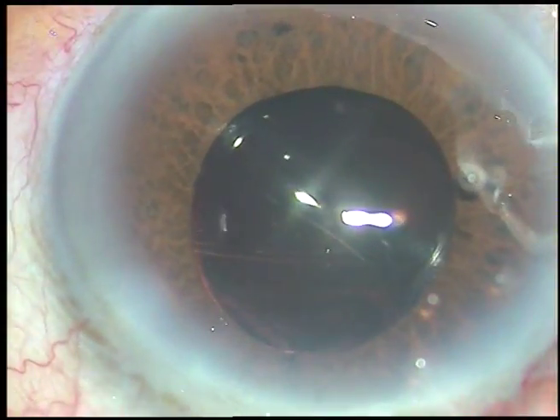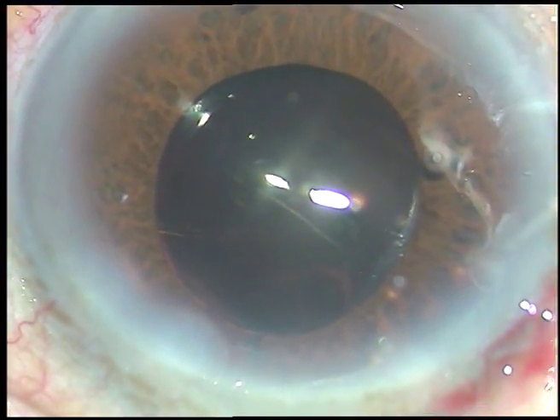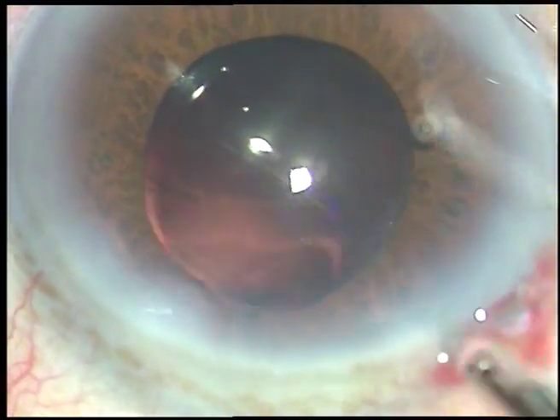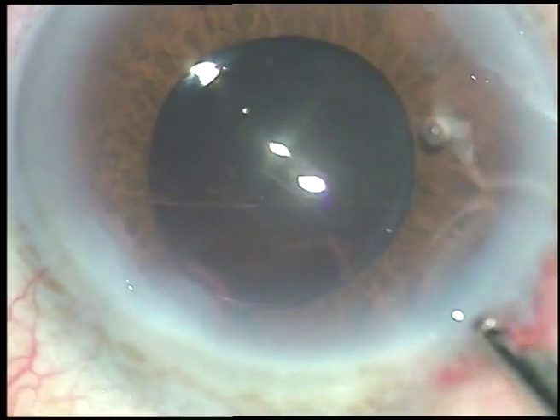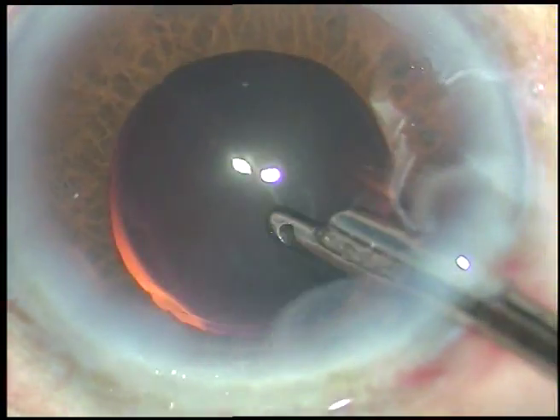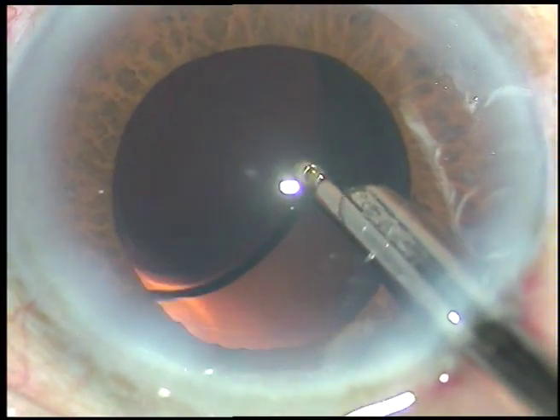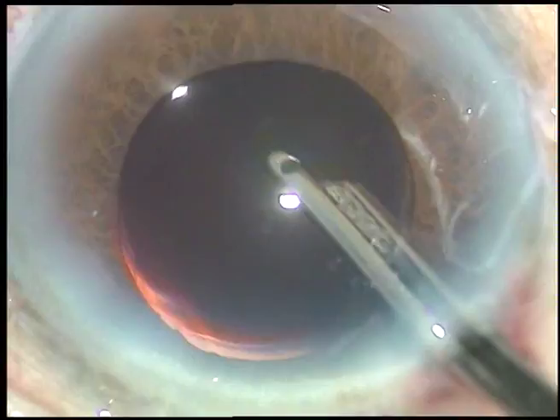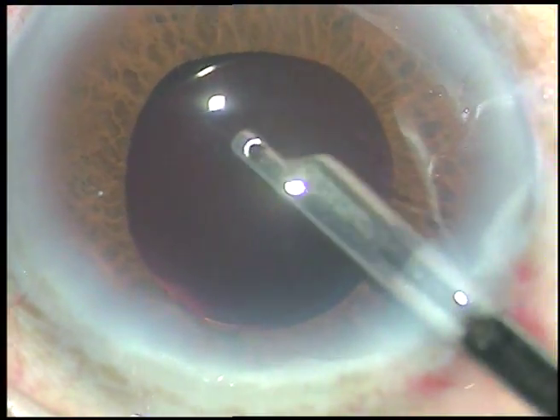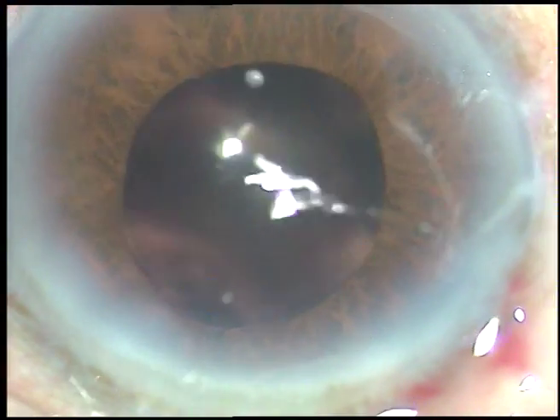The single side port is hydrated. Now a final wash is given. At this time, the viscoelastic BSS is directed towards the corneal endothelium — see what happens. Some viscoelastic substance sticks to the corneal endothelium and comes out at this time. Now this is the final wash. Anterior chamber is formed and the case is concluded. Hope this video will help you in developing your surgical skills. Thank you very much.